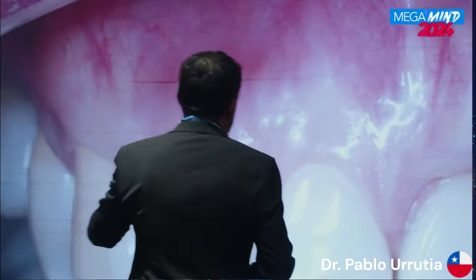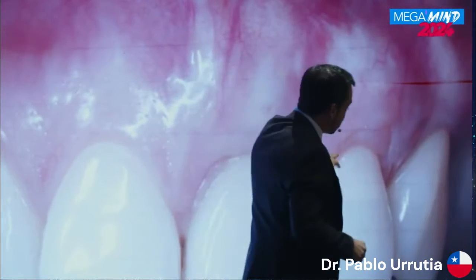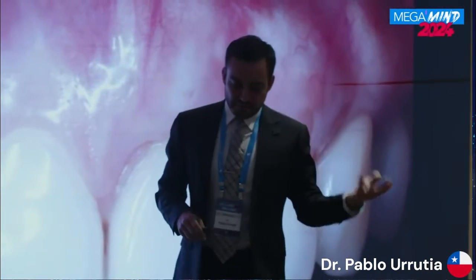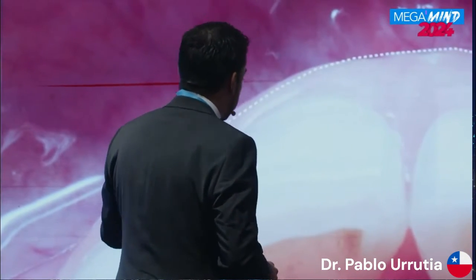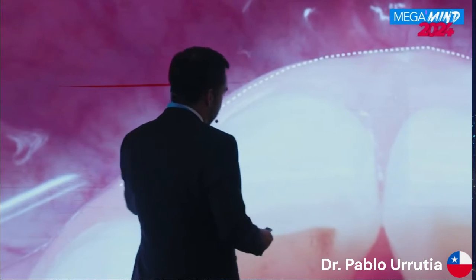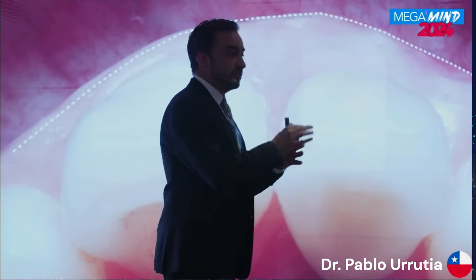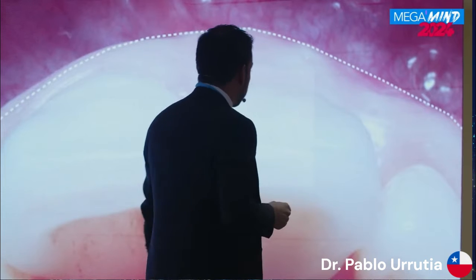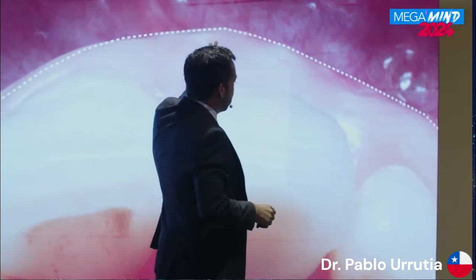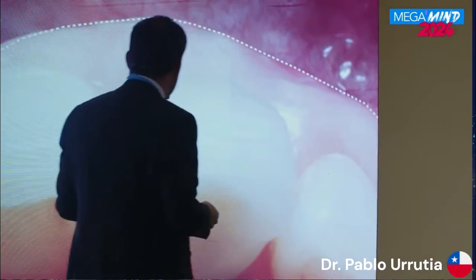As you can see, this is the final restoration where we restore the gingival margin, the thickness, we restore the gingival recession of the 2.2 and the canine. And you can see this is what we reached with the patient. It's very important for us that the crown has the same level in the palatal aspect, so the patient doesn't have some issue with the tongue when they pass the tongue in the palatal aspect of the crown. And you can see here the restoration of the thickness and restore all the emergence profile of the 2.1.